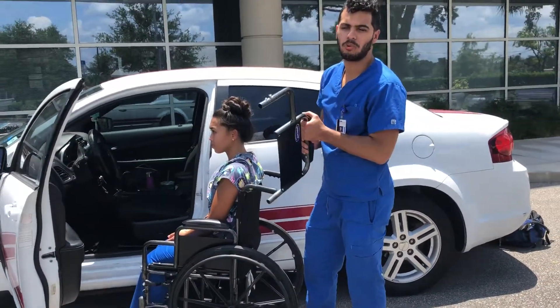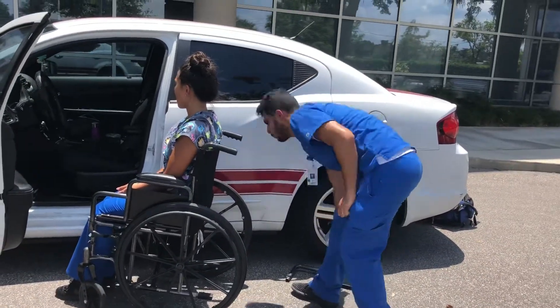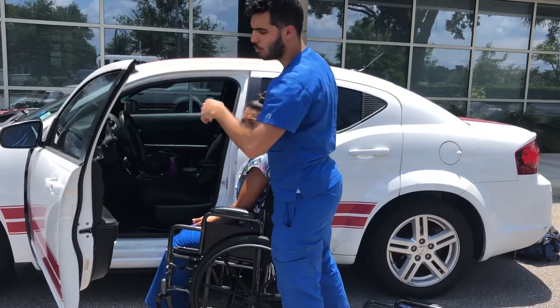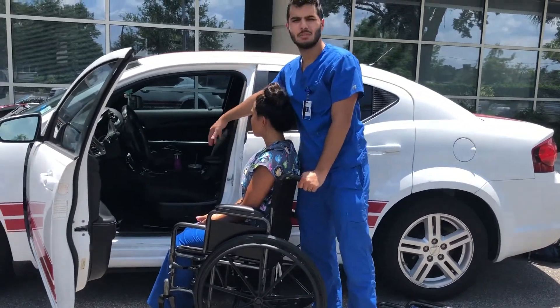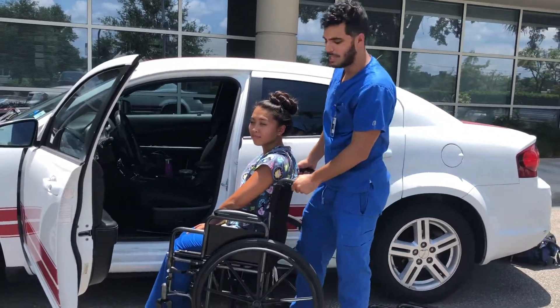The first thing you want to do is remove the armrest, because that's just going to be another barrier for her. When we're doing the transfer, some of the precautions are that she does not want to hold onto the door because the door can slide open, it can slip, and it could clench her hand if she goes inside. Also, the seat — you want to pull that back before everything.